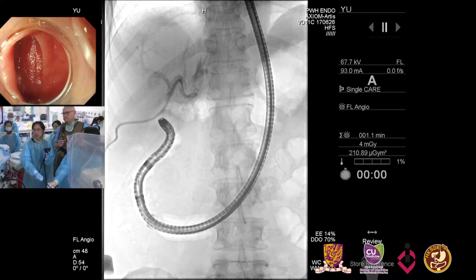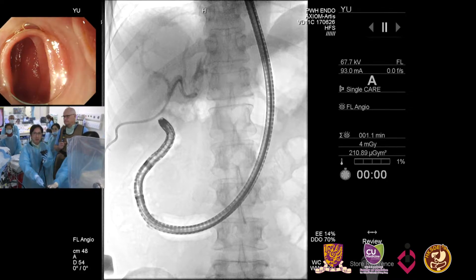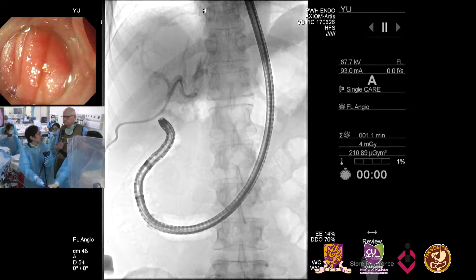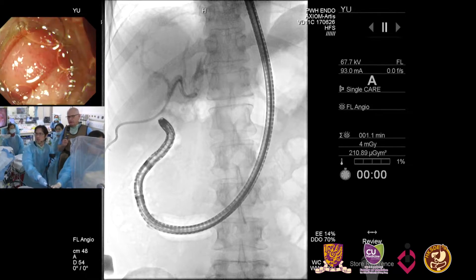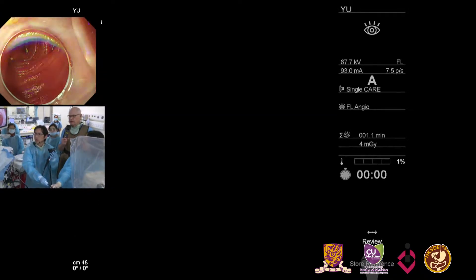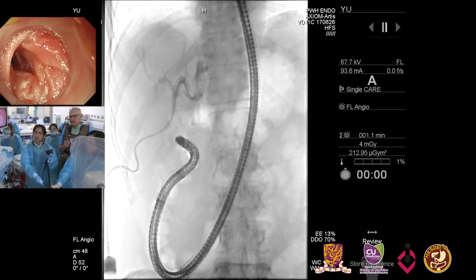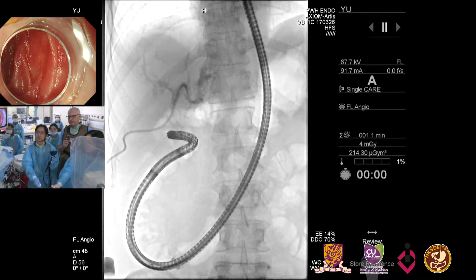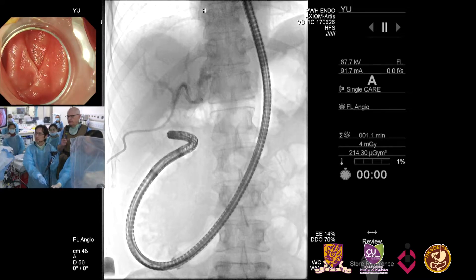I was chatting with Rob about how people would do ERCP in post-Whipple patients. A lot of people will try the pediatric colonoscope. We would sometimes try even the side-viewing endoscope — there are still a few people with a short afferent limb. But the key is obviously the length of the afferent limb, and in this case we would not be able to get to it with a regular ERCP scope.